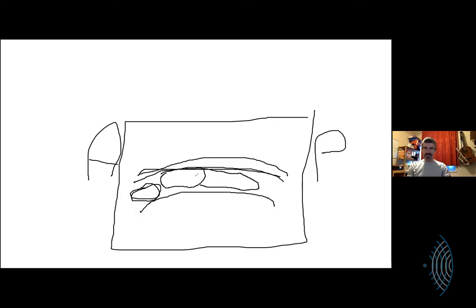When you look carefully, you will see that the front of supraspinatus is like that. And you'll see that the rest of supraspinatus is less distinct there. Then, usually about here, you'll see a sort of dark triangle where you don't seem to be getting as good a picture. Like that. And this tends to slide off, sometimes making a proper V shape. And this is all black.